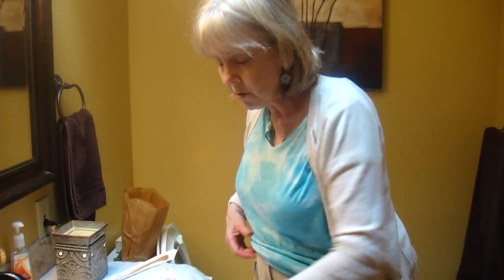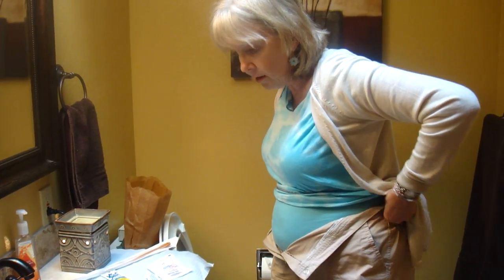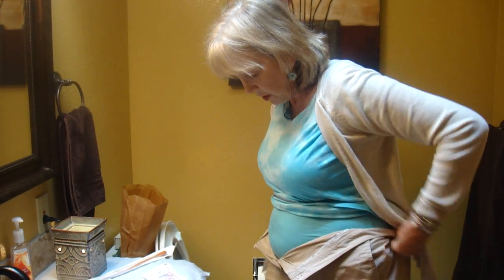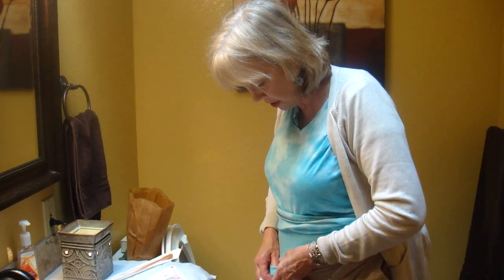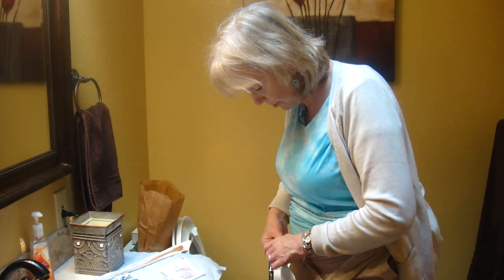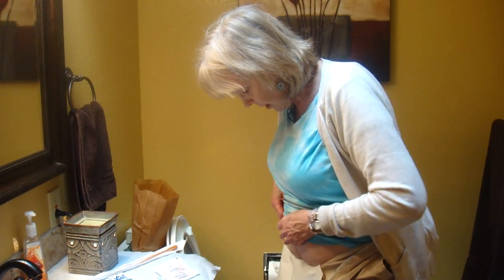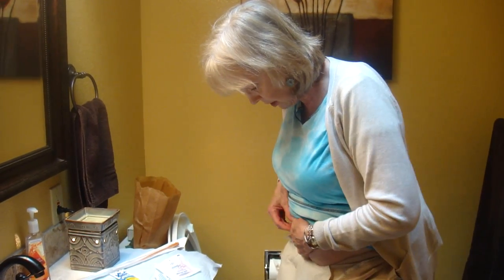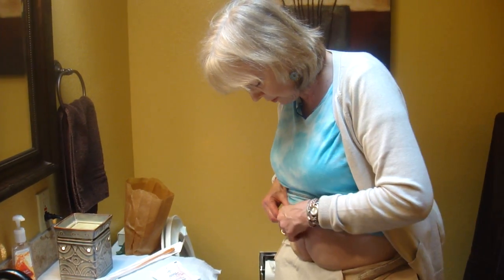I'm going to get started here and show you how I do this process. I'll pull down my pants here and show you how to catheterize your stoma if you're going to get an Indiana pouch or thinking about it. I have a little t-shirt I wear underneath my shirts a lot of times because this will help keep my clothes clean through this process. I'm going to put a little paper towel here underneath to catch any lubricant that might drip, and I'm going to pull off my dressing here.